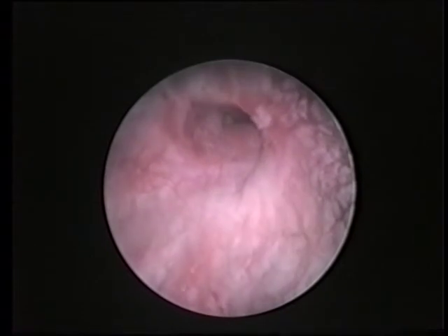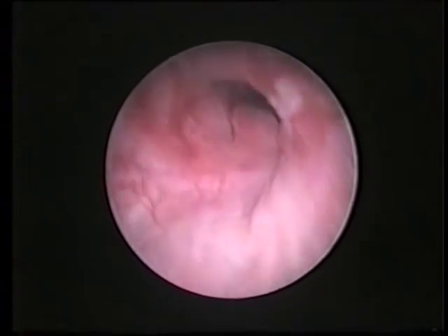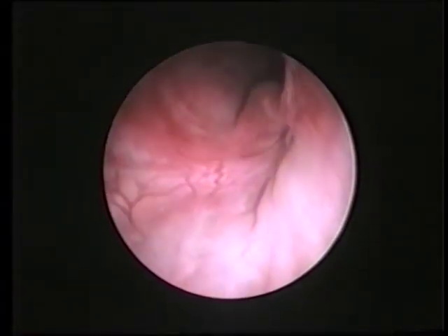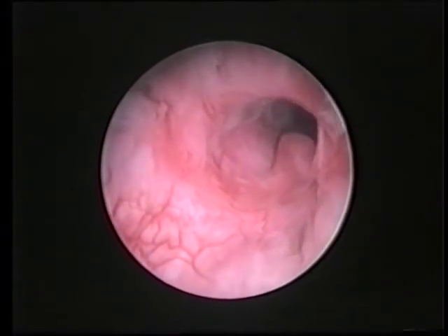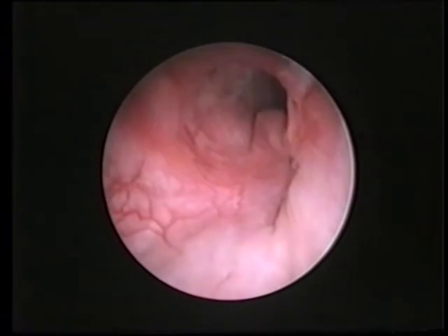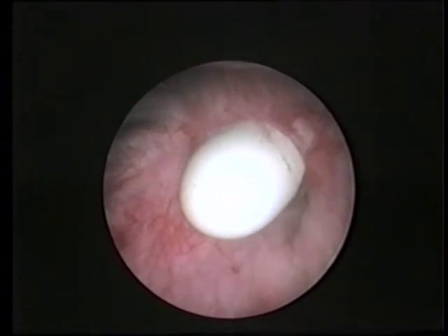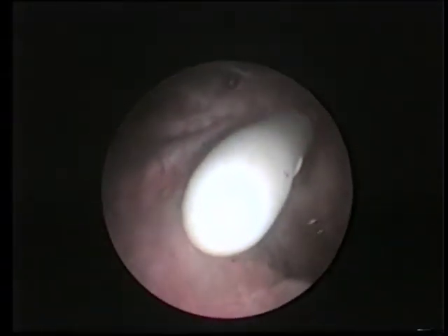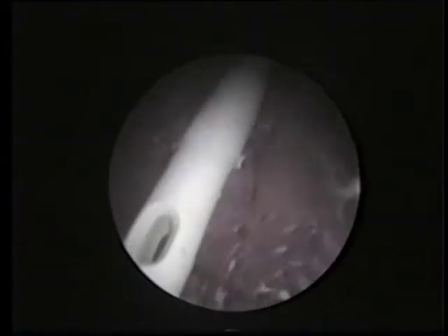The suprapubic tract first passes through the bladder wall, and this can contract quite rapidly within a matter of minutes, so that it becomes impossible to reintroduce another catheter. Any delay in replacing the catheter should be avoided. A new catheter is introduced. The clean, smooth surface and rounded borders to the eye holes are designed to minimize the risk of encrustation and trauma. The balloon is filled with 10 milliliters of sterile water.